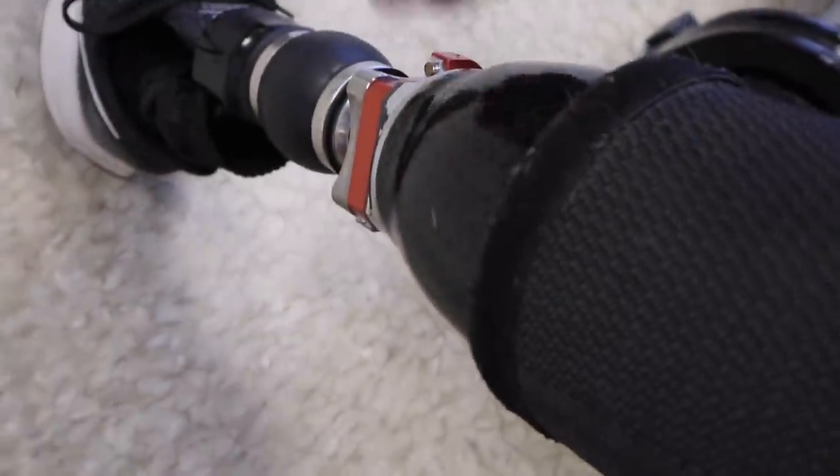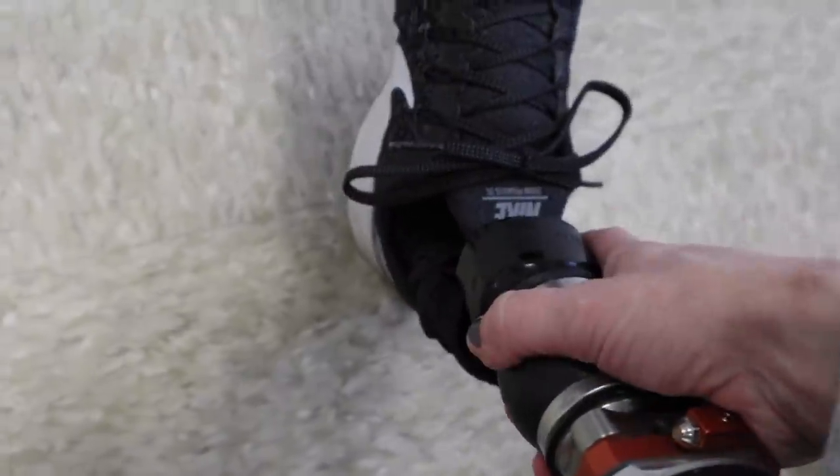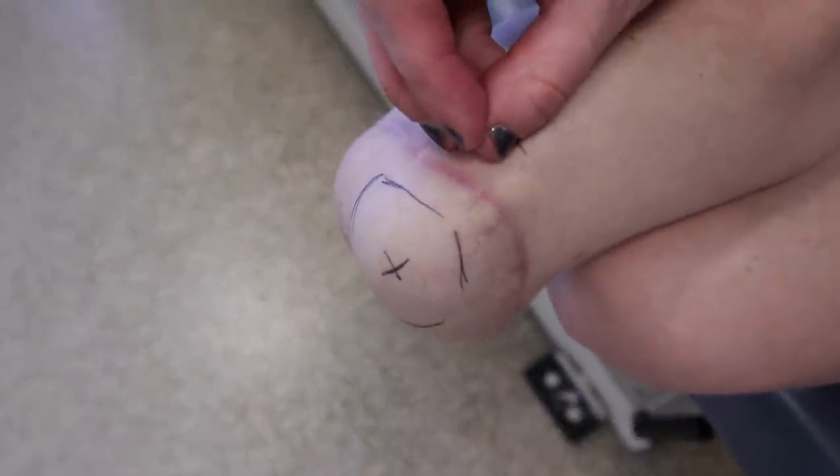In case you're confused, this is where my socket actually ends — this part is my socket, it goes up until about right here, and it's what actually holds my leg. Then this is the part that's always stayed the same — the ankle and foot area. So we're replacing the socket part today. That area I've circled is really where we're having a lot of issues, so we're going to try to build up a pad around it for the direct socket.